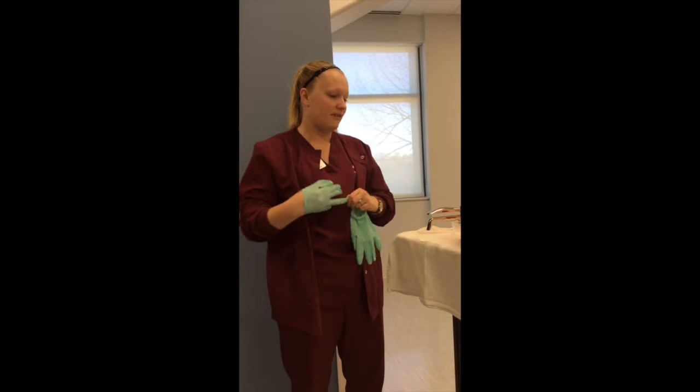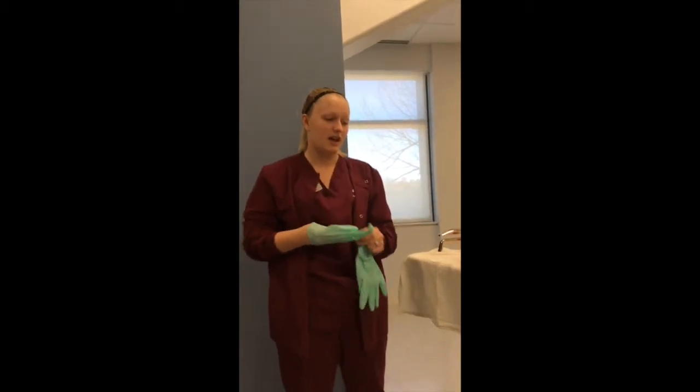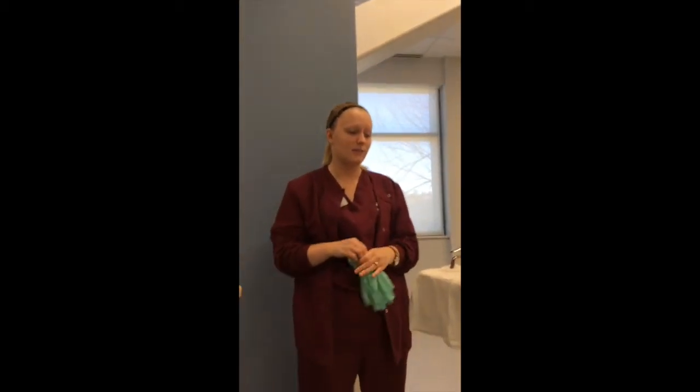And then if it's a feeding tube, like I said, I'm going to go ahead and leave the room and come back in 30 minutes to hook that feeding tube back up. If it's suction, I'm going to do the same thing. I'm going to keep it clamped and keep the suction off for 30 more minutes at least. That way it can get absorbed.